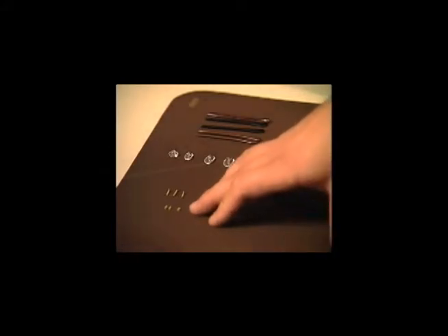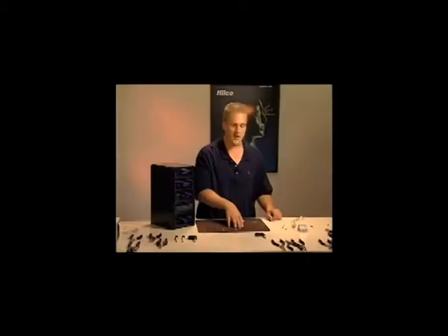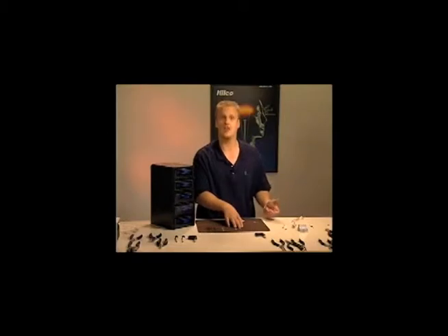The first screws here are your standard replacement screws. Those are used in applications where you were able to remove the screw without damaging the hardware of the frame, or if a customer walks in and the screw has just backed out and you need a replacement screw. That's the type of screw to use. It's really an OEM equivalent. It has a specific diameter and a specific length and a specific head size to fit the need.